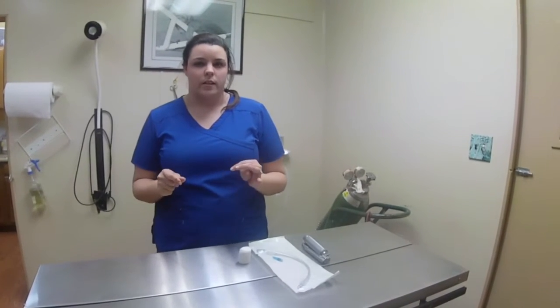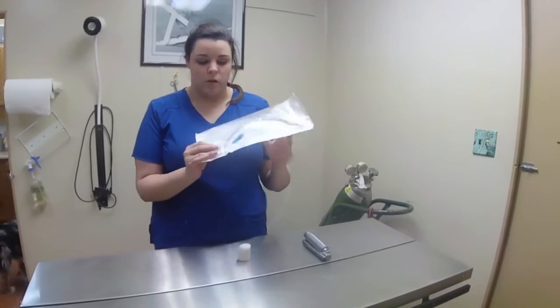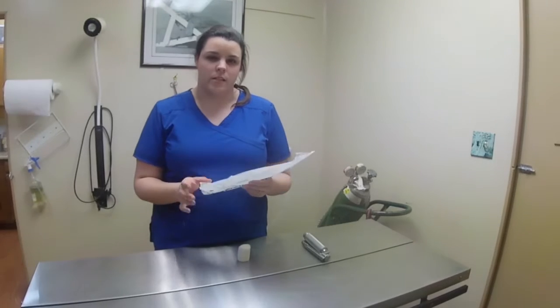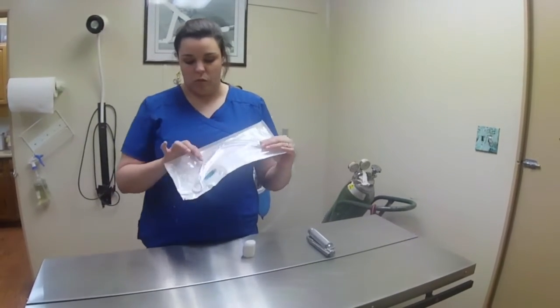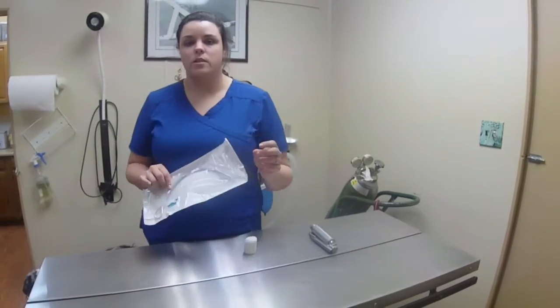Okay. Brachycephalic dogs tend to have smaller tracheas. Even the cats do as well. So you need to take that into consideration compared to your mesocephalic dogs who have normal size trachea. We have a system where we base it on weight. This is a size 6 trach tube. This would be for roughly 10 pounds of the dog. You have where it connects to your oxygen and your gas. Your tube will go down the trach, and then you have a cuff here that you will inflate to make sure that you have covered all areas.